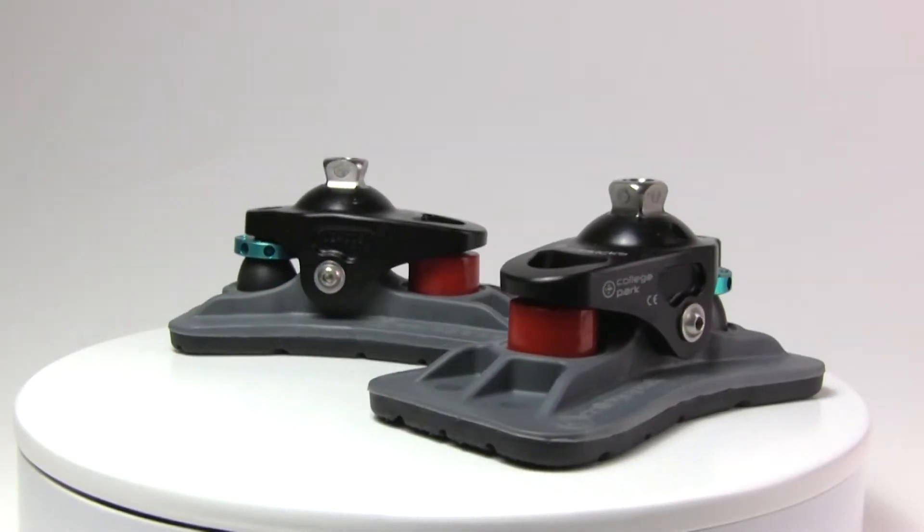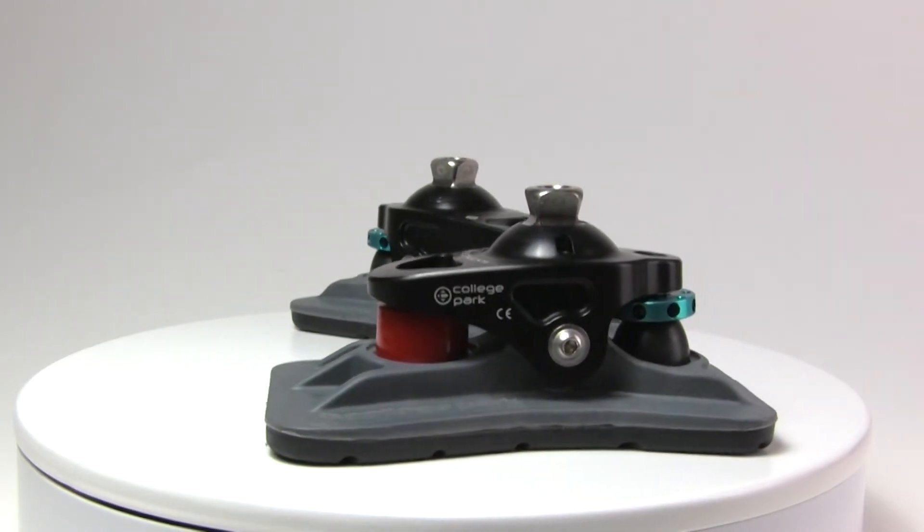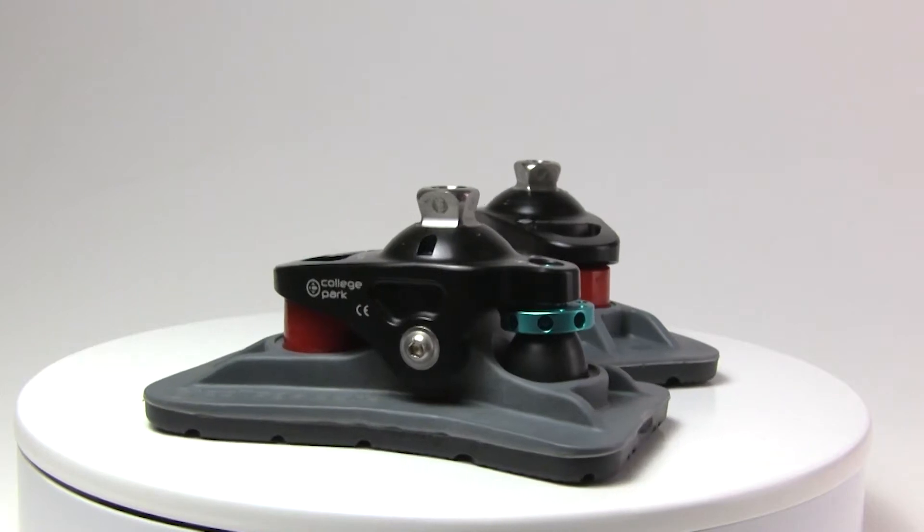The College Park Sidekicks are revolutionary new stubby feet for bilateral transfemoral patients with gait-matched anatomical movement, a molded tread, and excellent ground compliance.